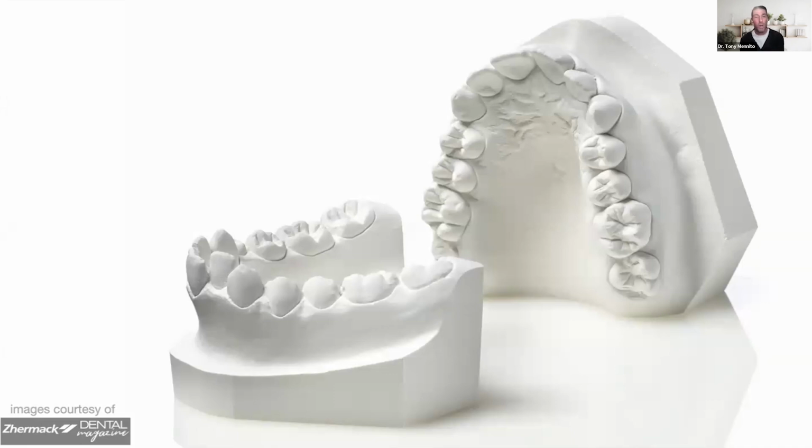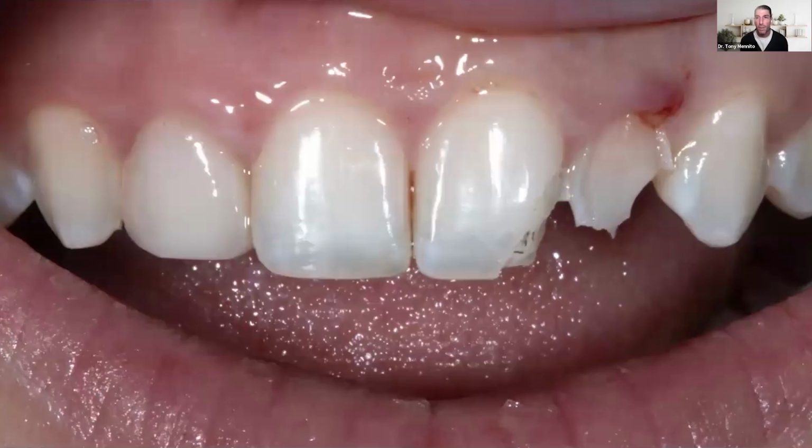And I've been in private practice dental offices, particularly ortho offices, that still store these models. Of course, my models never looked this good, but you get the idea. Now we put them in the cloud, on a hard drive, or on a server. It's much easier to store this data and not have the massive storage issue that we used to have.